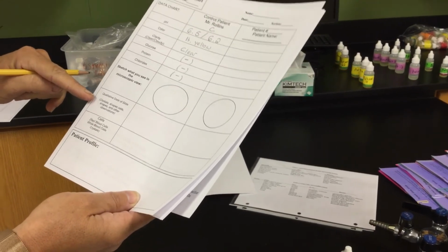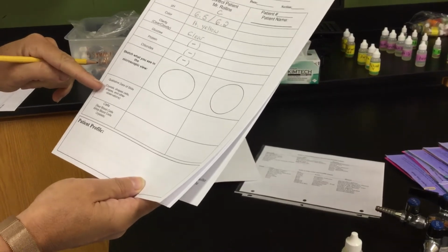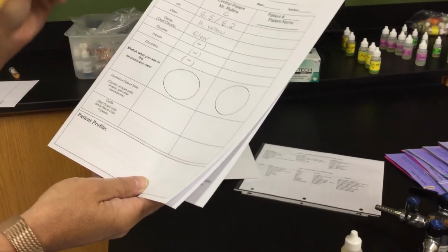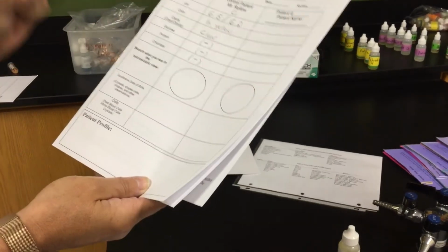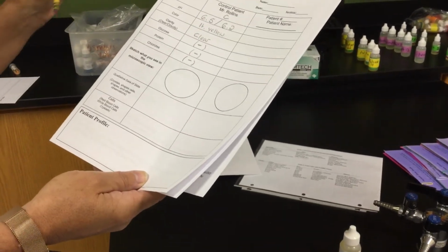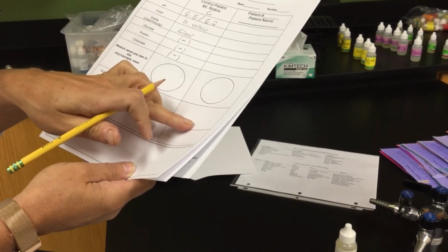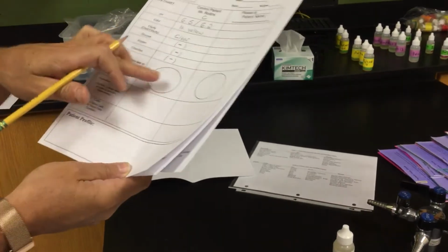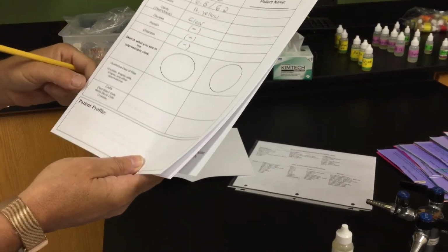So do you see crystals? Do you see shapes? Do you see cells? Do you see anything else underneath that particular one? You don't have to put, oh, I see the arrow of the microscope. I don't need that. Mr. Rollins normal, so he shouldn't have crystals. He shouldn't have shapes or cells or anything else in that. That's there so that when you get to your other patient that you're going to use to compare with, that's where you guys are really going to come in with that qualitative. Do you see any cells?